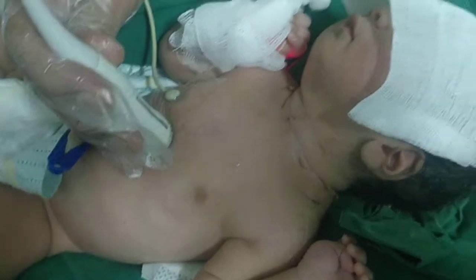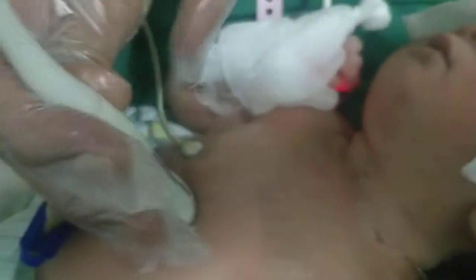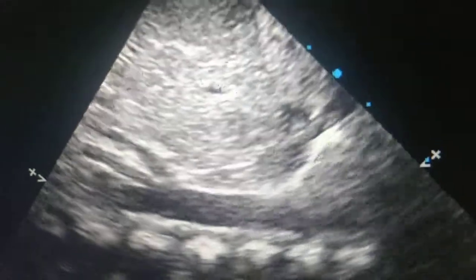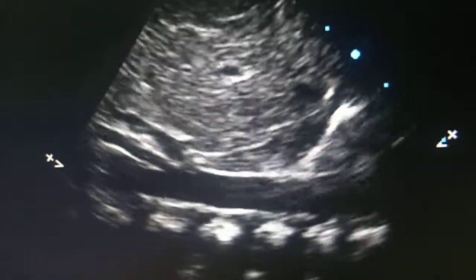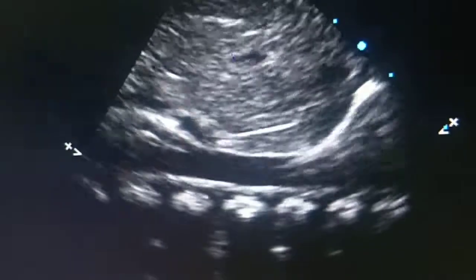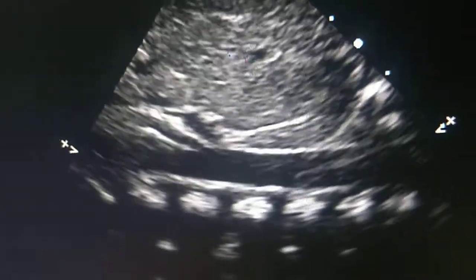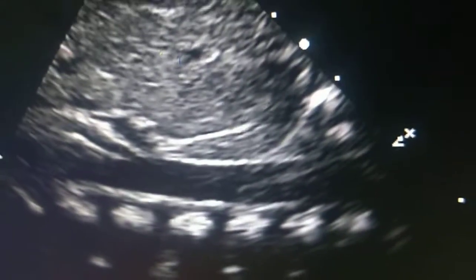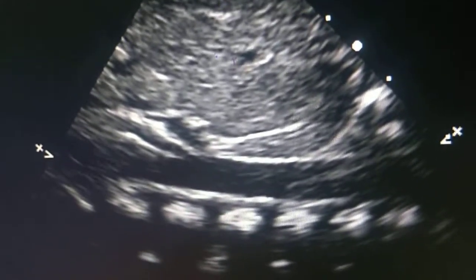Tilting to the subcostal sagittal view, with the marker repositioned, you can see the vertebra, the descending aorta, and its branches. I freeze and show: the vertebra, descending aorta, and coming off it the celiac artery and then the superior mesenteric artery. This is the subcostal sagittal view to assess the aorta and its branches.